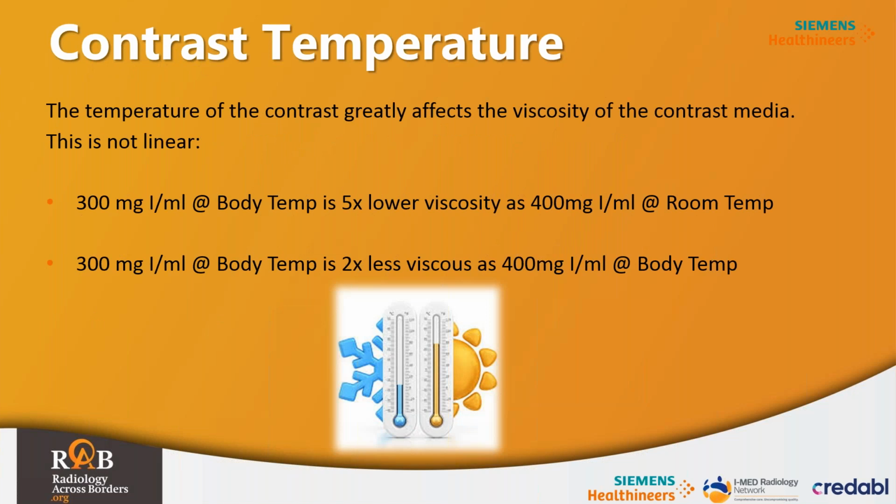So we've already briefly spoken about one of the properties of contrast, its viscosity. Typically, we want to raise the temperature of the contrast roughly to body temperature. This enables easy flow and reduces the potential for a reaction. Just to put that in context, if we leave a 100 mL bottle of contrast on a bench for an hour, it has dropped approximately 50% already.